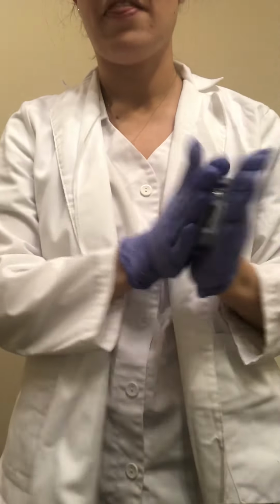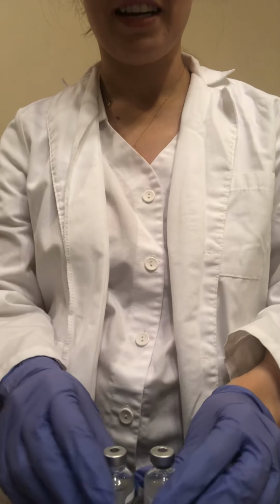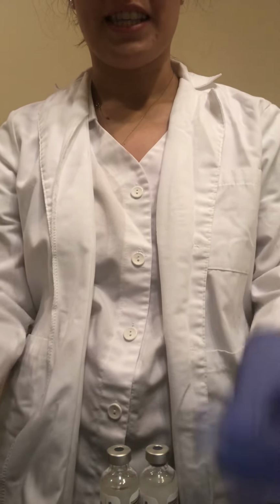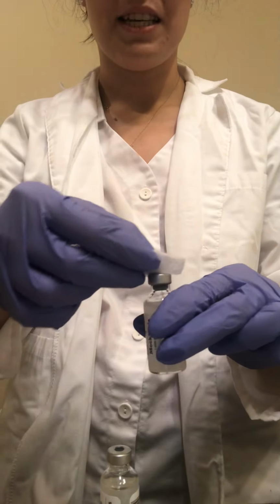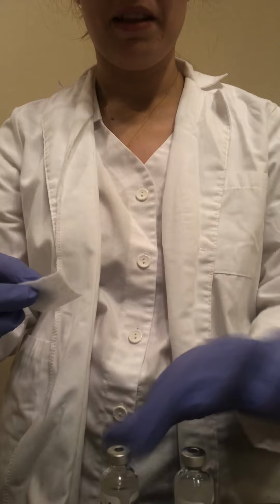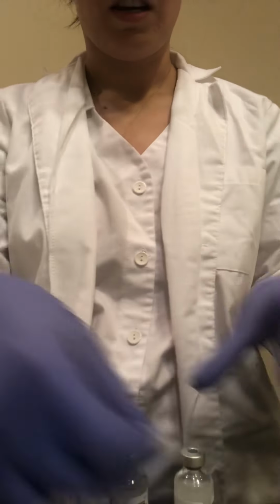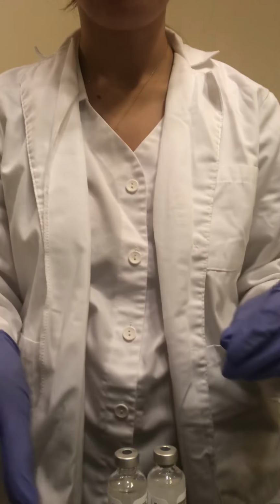And the first thing that we're going to do is we're going to roll these vials just to get the insulin all mixed up. All right. These are nice and mixed. And the very next thing we're going to do is just wipe the tops of these with a little alcohol swab before we put the needle tip in there. And this is all for infection control.